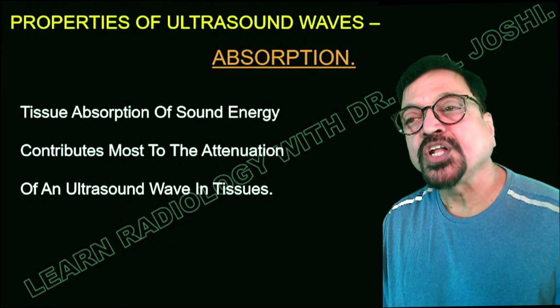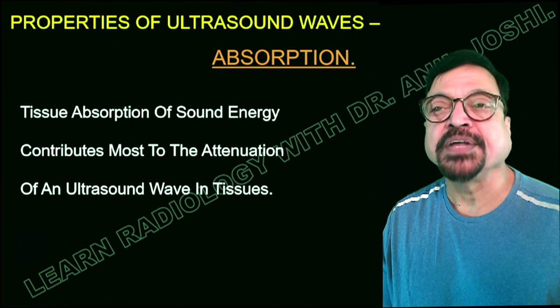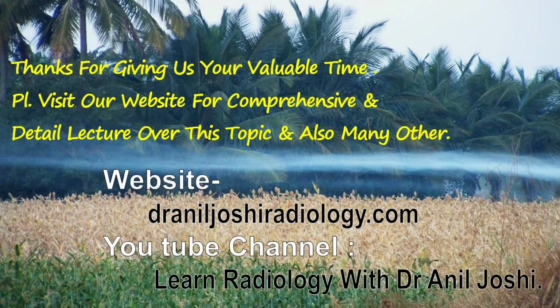Then we'll come to absorption. Tissue absorption of sound energy contributes most of the attenuation of an ultrasound wave in the tissues. With this, we are ending our brief lecture on properties of ultrasound.